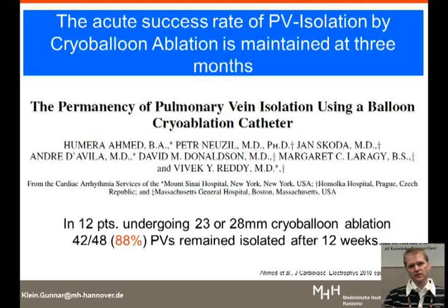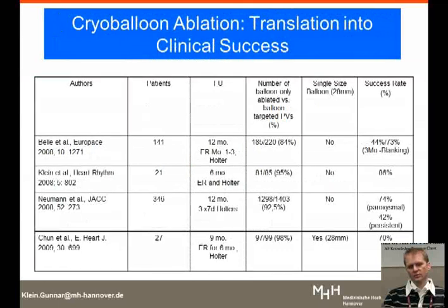What helps in doing cryoballoon ablation is to use another transseptal puncture site than we are usually used for pulmonary vein isolation. So we perform a more anterior and more inferior transseptal puncture to get more space in the left atrium to manipulate the catheter to the right inferior vein and to have more space between the sheath and the right pulmonary vein and to get the balloon more in alignment with the course of the right inferior pulmonary vein.